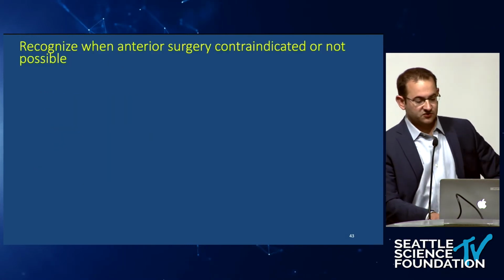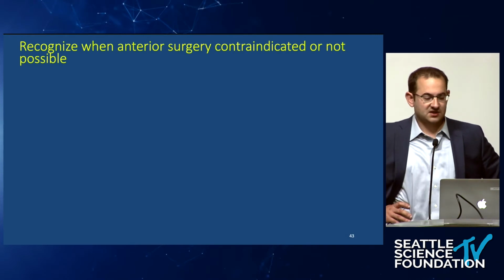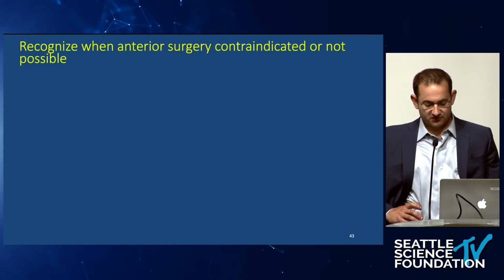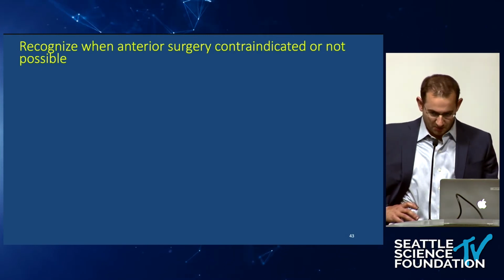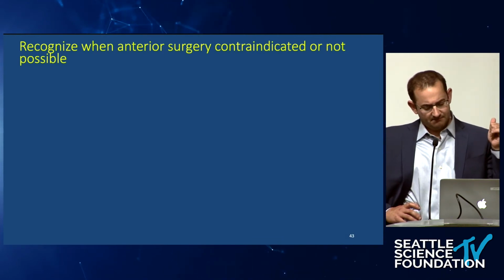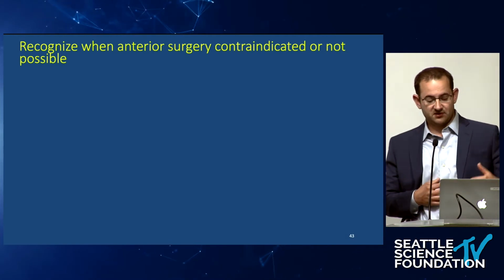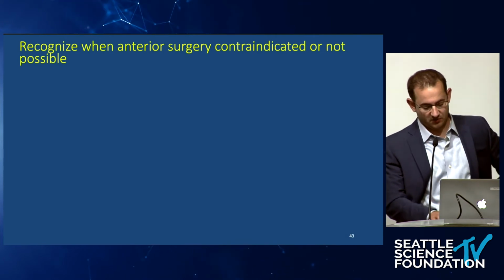And I just want to close with a reflection that there's obviously a role for certain procedures, and I've loved the power of these expandable corpectomy cages. I've had a lot of these focal kyphotic cases, whether they're degenerative, infections or tumors, where I've been able to get tremendous correction just from using halos and the expandable corpectomy cages.